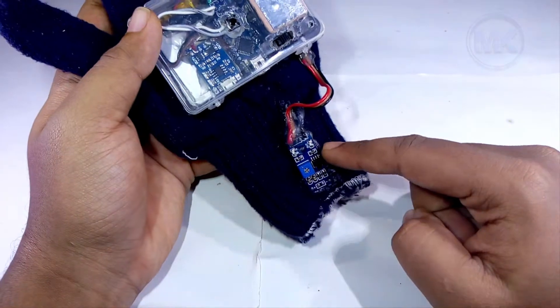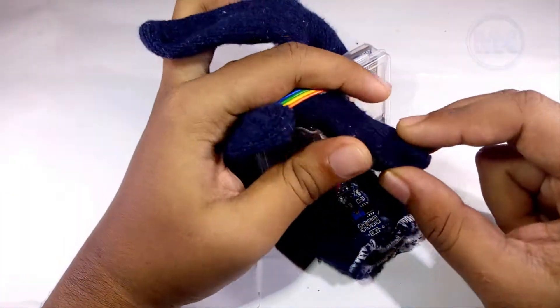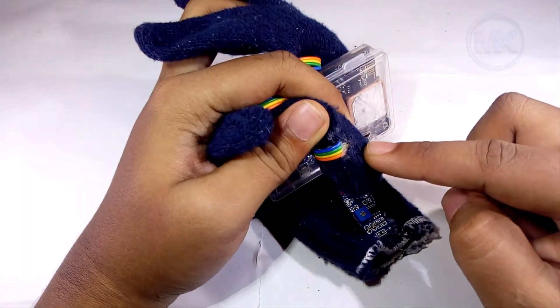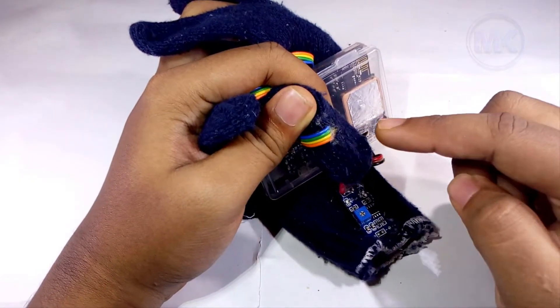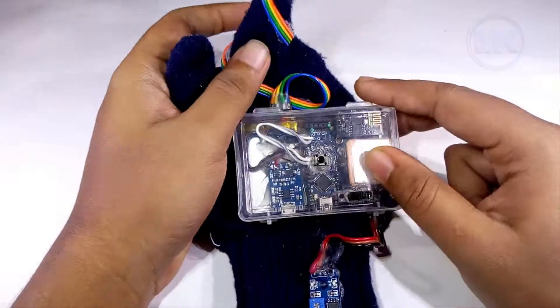This is a temperature sensor which measures body temperature, and here it contains a pulse oximeter sensor which measures pulse rate as well as the amount of oxygen levels in blood. It is fixed inside this glove.